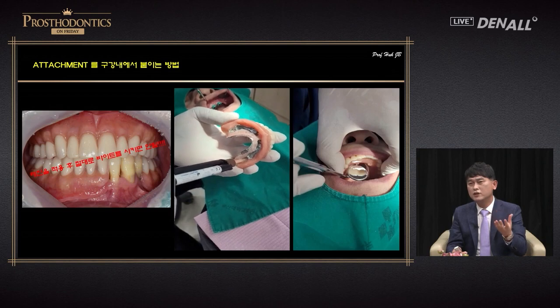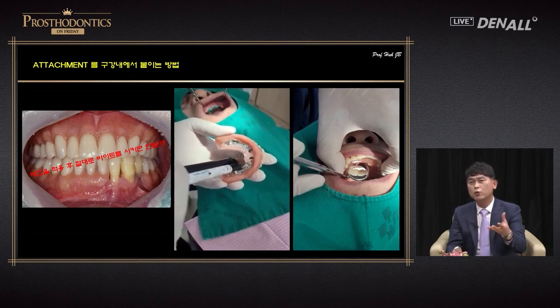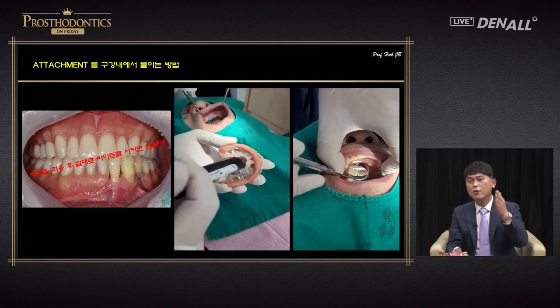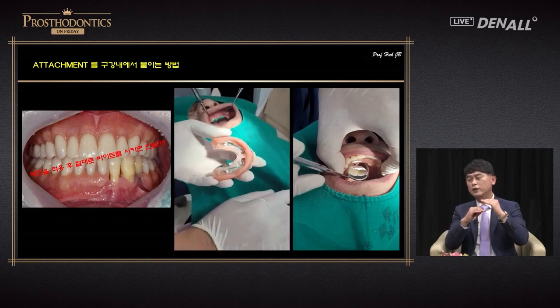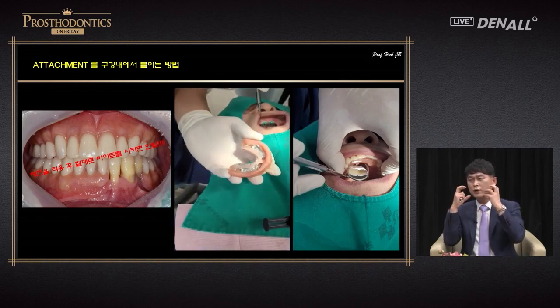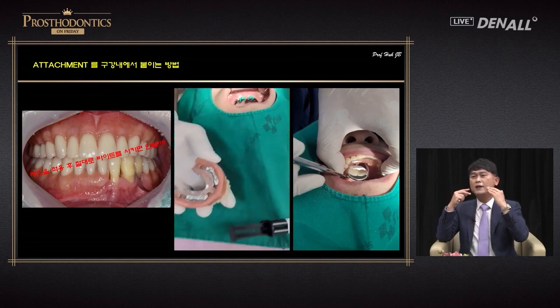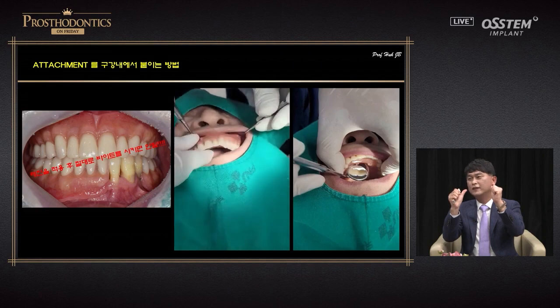To attach it in the mouth, MDP containing self-adhesive resin cement needs to be used because it attaches to zirconia and metal pretty well. When you attach it, never have the patient bite on it, even though the occlusion is very well adjusted. If the patient bites on it, it will tilt toward one side. A surgeon should press it down with hands.